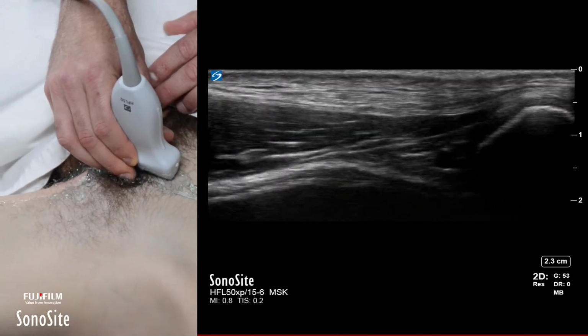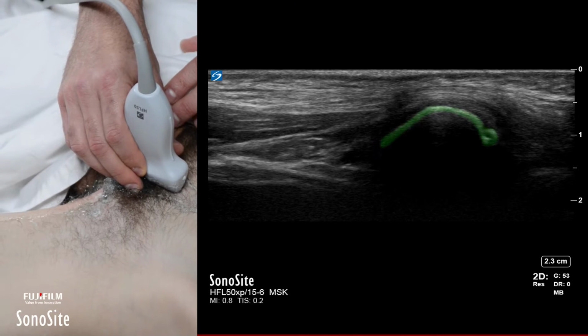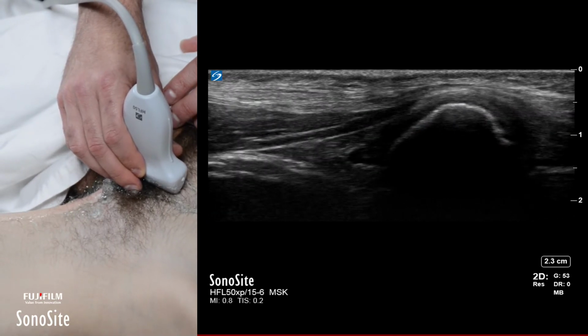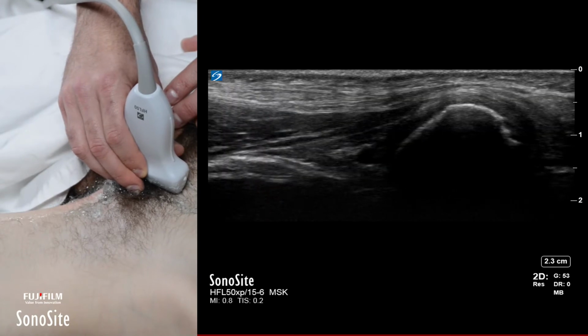and it starts to taper into a tendinous insertion onto the superior pubic ramus. The superior pubic ramus and the pubic tubercle are over in the middle of the screen. You see that bony acoustic landmark. And that's going to be that site of common aponeurosis between the superior pubic ramus and between the rectus abdominis and the adductor longus.